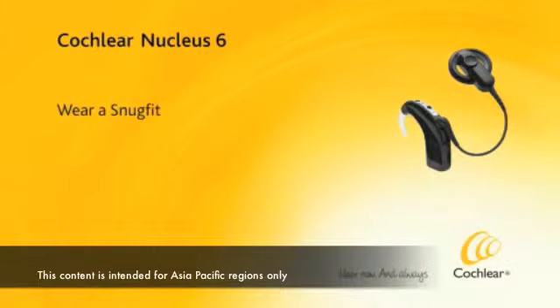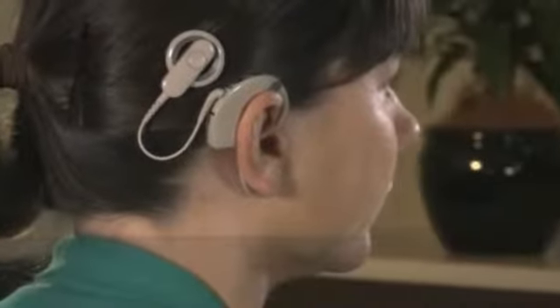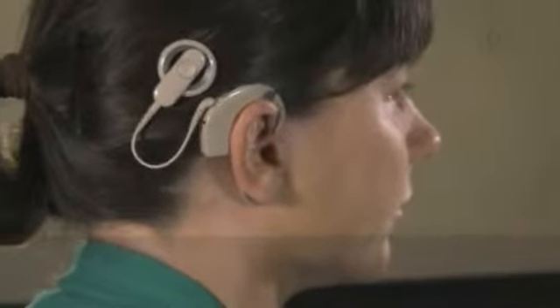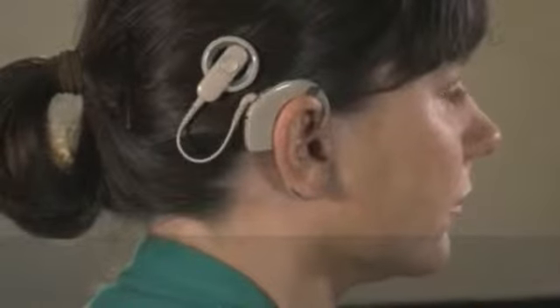Wear a SnugFit. The Cochlear Nucleus CP900 Series SnugFit holds your sound processor more securely in place than an earhook alone.